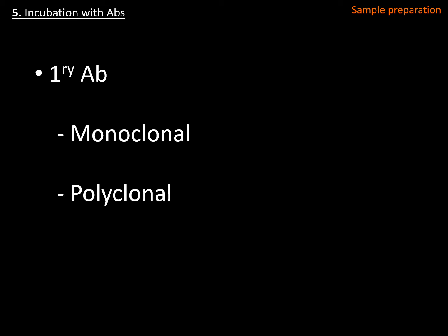So for this incubation, you first use a primary antibody, and this primary antibody is the one that actually detects and interacts with your target in your sample.